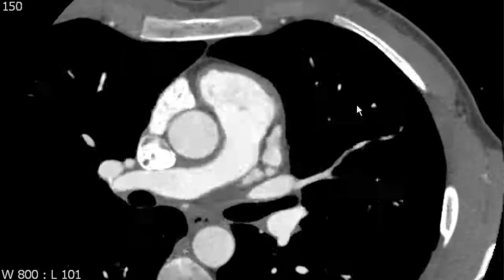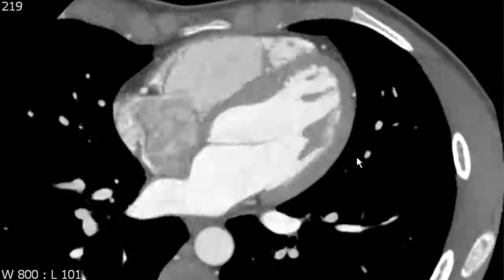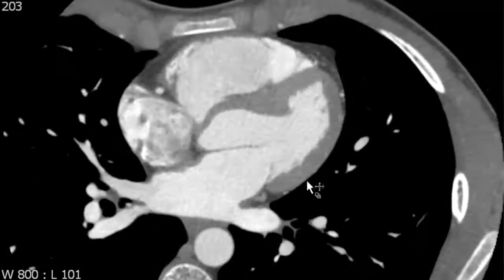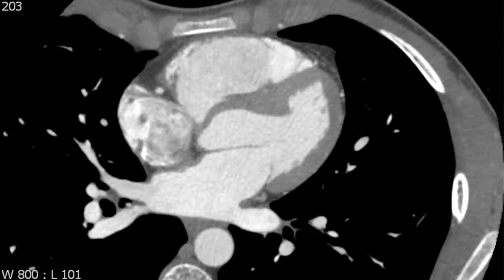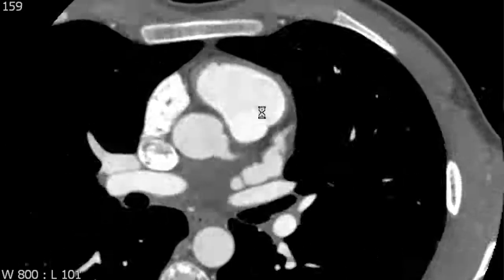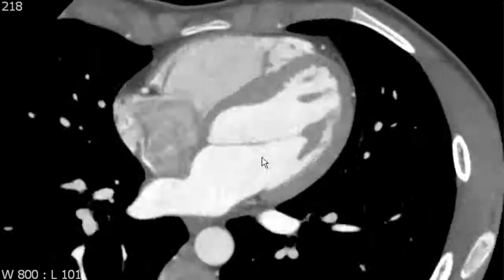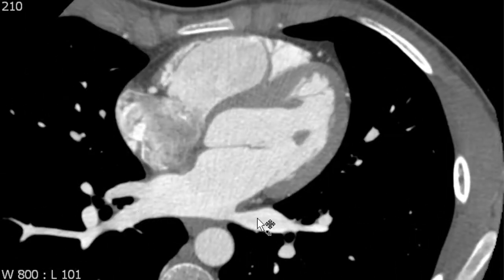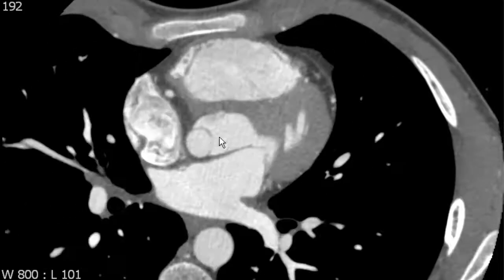Next we're going to review the left atrial anatomy. The chamber that's closest to the spine is the left atrial chamber. It receives blood from the lungs through the pulmonary veins, which join the left atrium at its posterior aspect on either side.